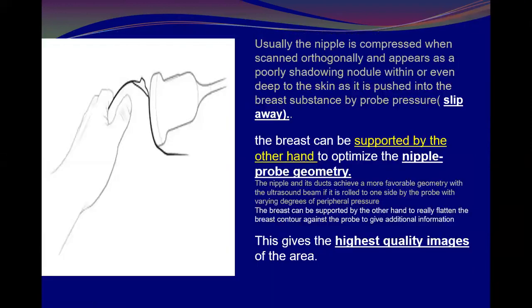Okay, another technique helping to visualize or to evaluate the nipple area is to support the nipple with the contralateral hand while you are pressing or pushing with the transducer, as seen in these illustrations here.